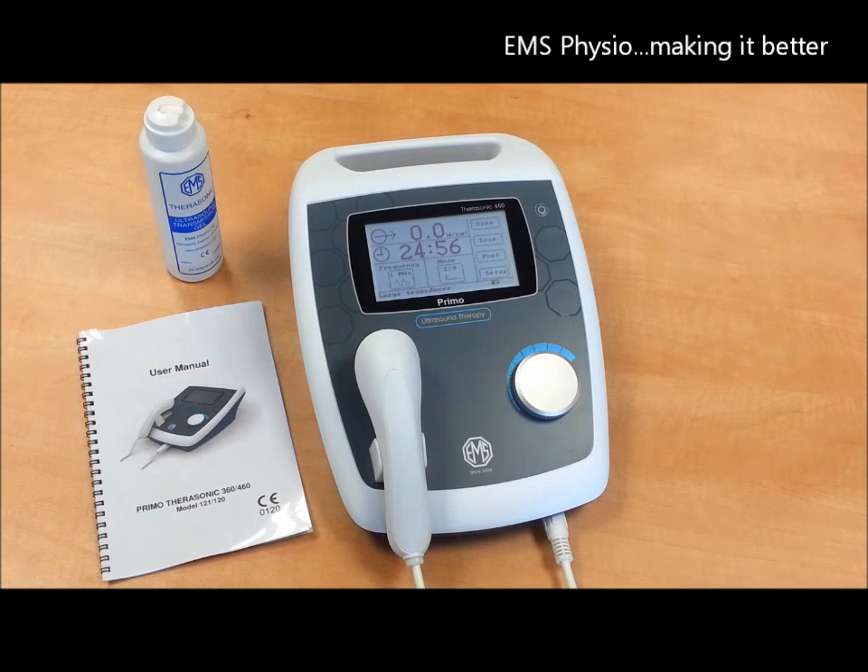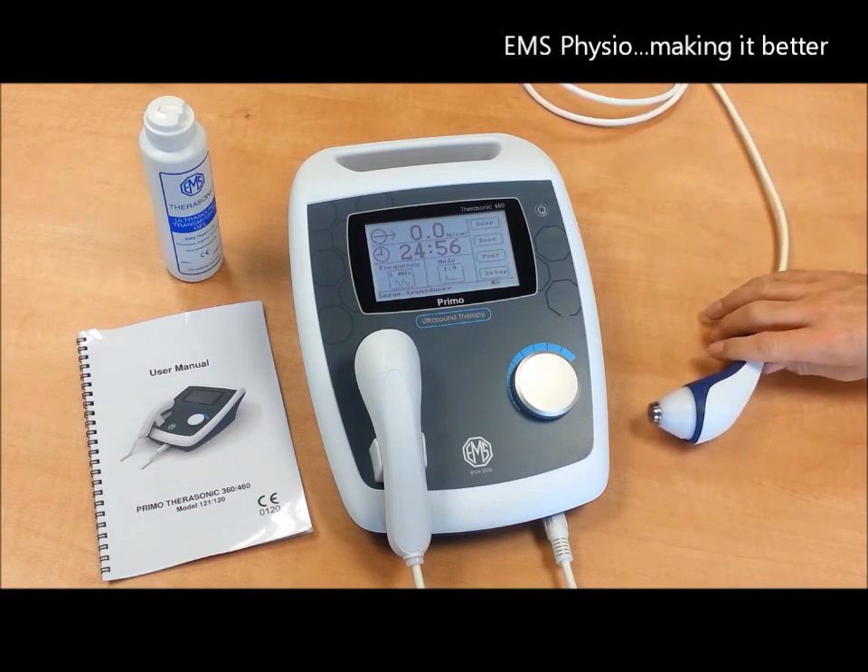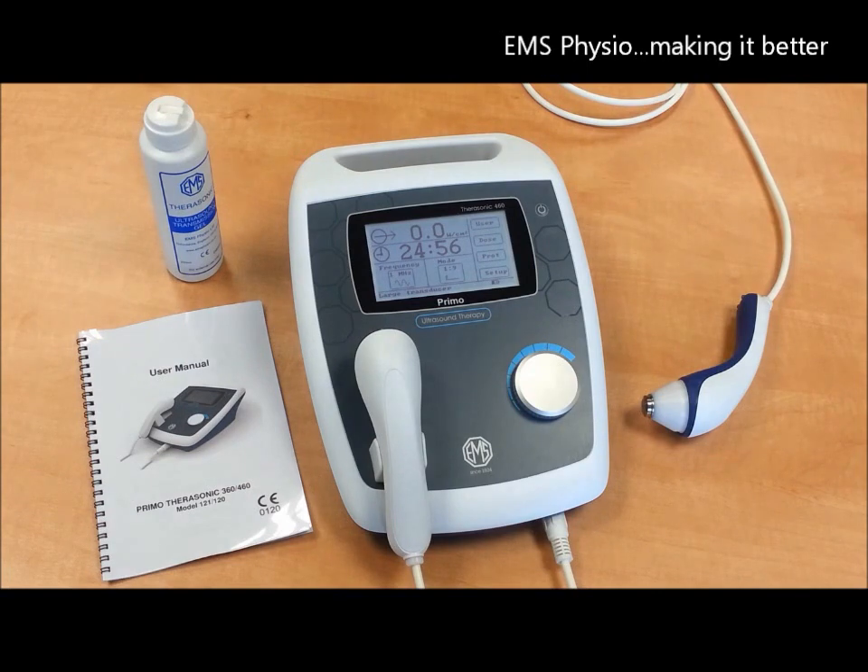Finally, the Therasonic 460 comes with an optional small treatment head, which is also dual frequency. You can also order a trolley or a sturdy and protective carrying bag for true portability.